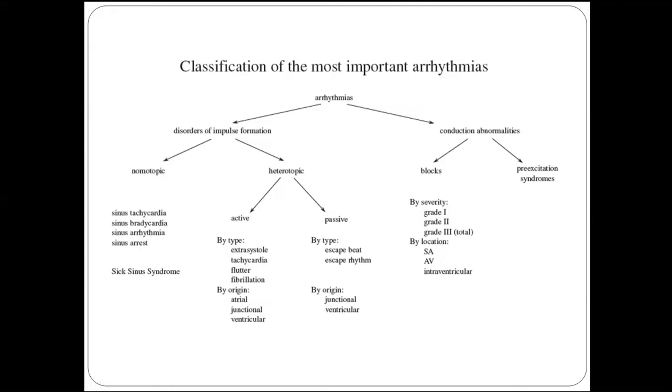Okay. The last time we started to discuss the arrhythmias, and we called arrhythmias everything else that is not a normal sinus rhythm. And we specified what the normal sinus rhythm is: basically it is rhythmic. The PP interval is normal. The RR interval is normal. Every P is followed by a QRS, the PR interval is normal, and the P originates from the SA node. The rate is between 60 to 100. That's the normal sinus rhythm.